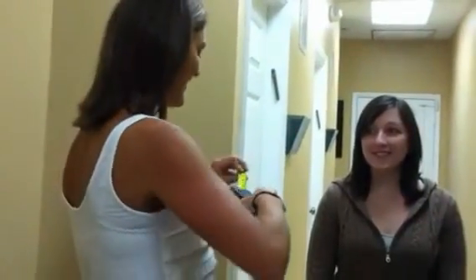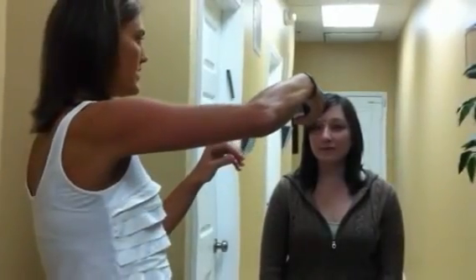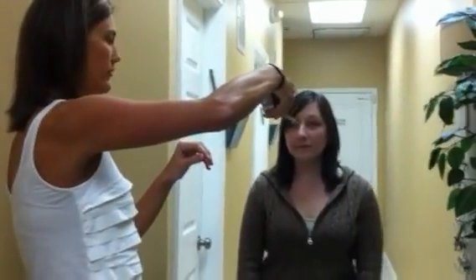So this works, it is perfect, it is simple. But make sure you have a friend take your picture. You do about 16 inches away — kind of forgot to show you guys that earlier — but this is the distance that you want to be away from your friend. It doesn't have to be exact, but that is a very important part.